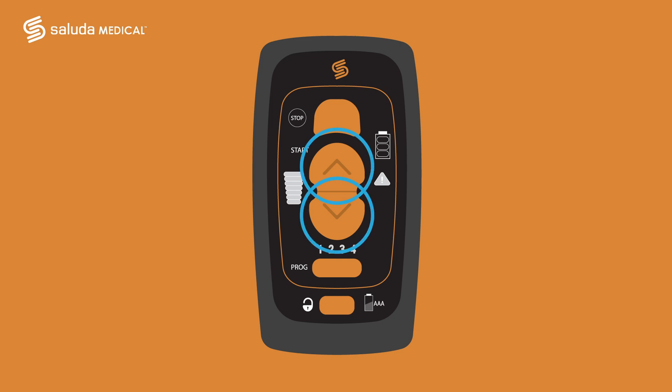Now that you are connected, let's look at how you can control your therapy. The up and down arrow buttons allow you to increase or decrease your stimulation intensity. The stacked green bars on the left are called the therapy intensity indicator. As you push the buttons to change the intensity of the stimulation, the number of green bars will go up or down depending on your adjustments.